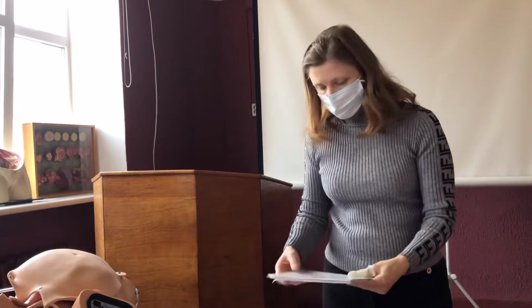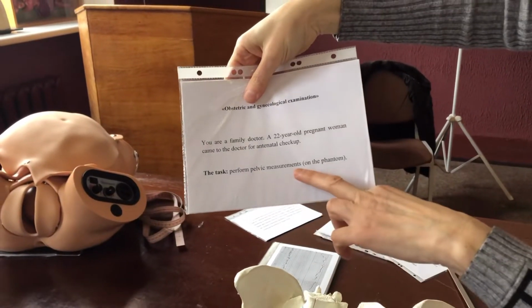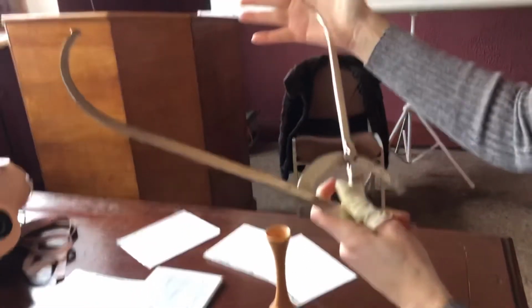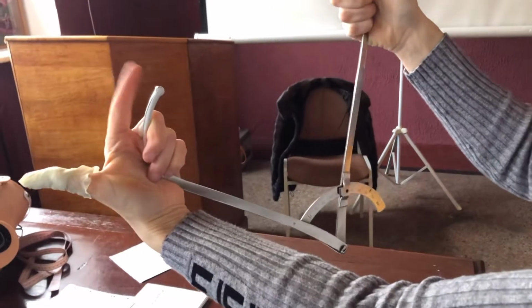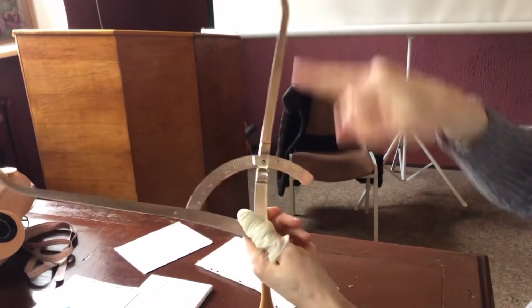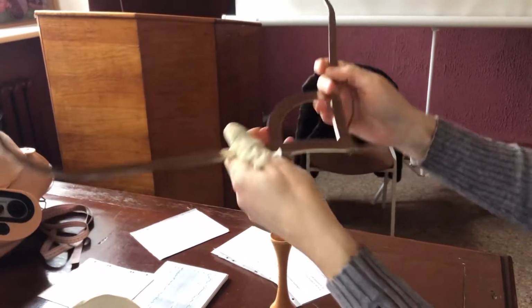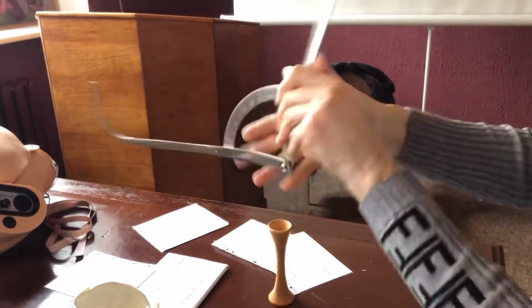And during the exam, you will see a short situational task. For instance, the task: perform the pelvic measurements on the phantom. So, and this is the correct position during the examination. 3 index fingers. And guys, you should see the numbers. If you take it like this, it will be incorrect because you don't see the result.